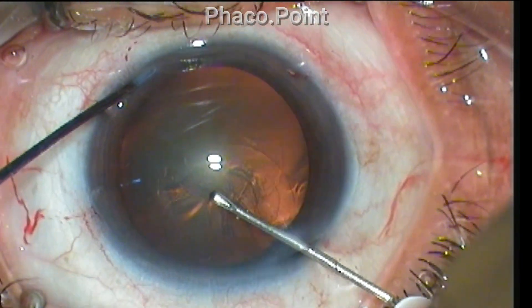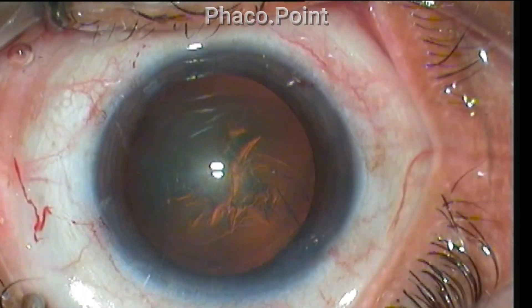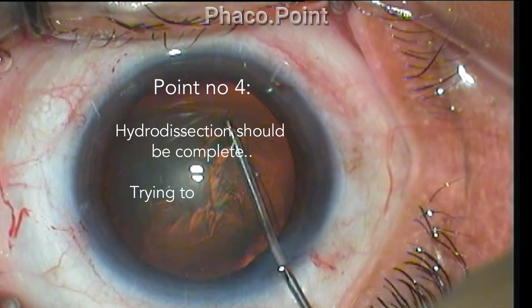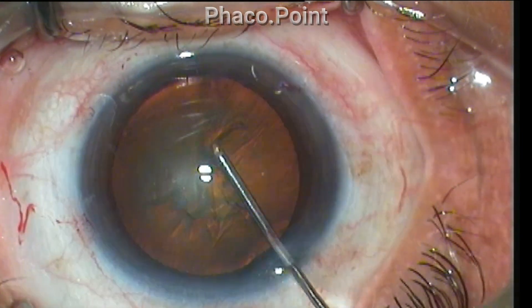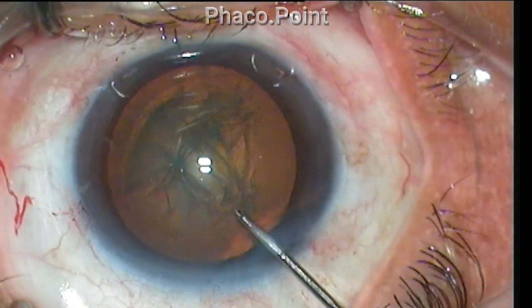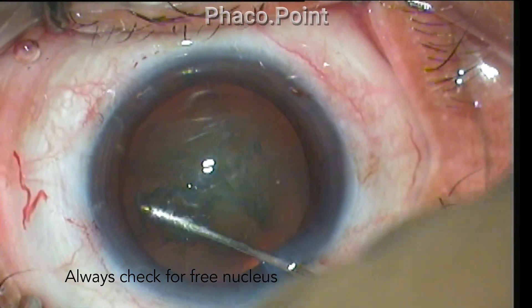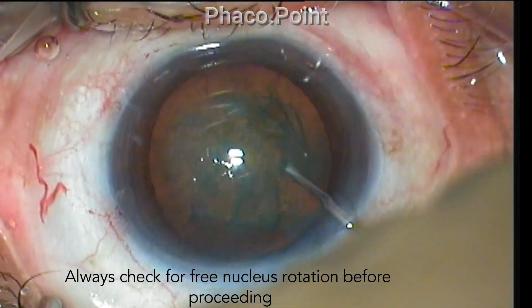Getting good eyeball fixation is important to perform the capsulorhexis. Point number four: hydrodissection is crucial. It should be complete and well done, because trying to rotate the nucleus with improper hydrodissection will induce pain due to the tug of zonules onto the ciliary body. Ensure that cortical cleavage hydrodissection is complete, and always confirm that the nucleus rotates well before embarking on phaco under topical anesthesia.